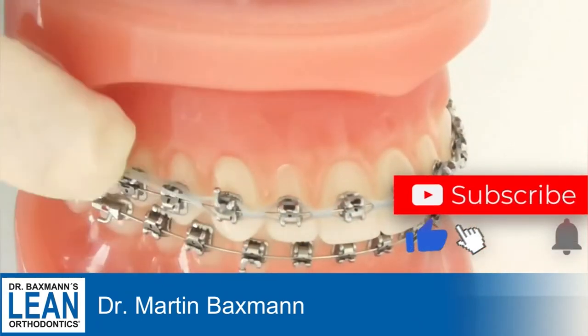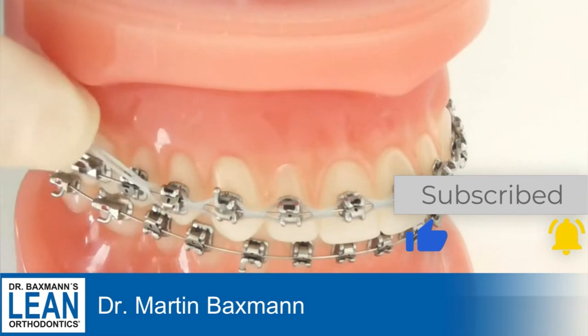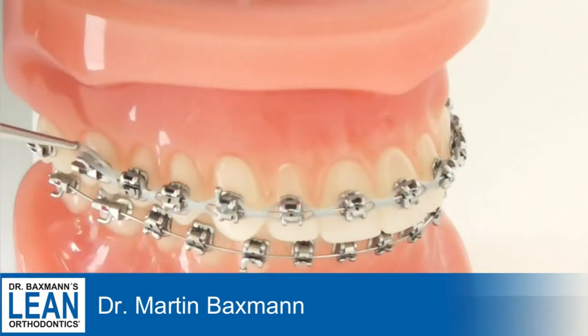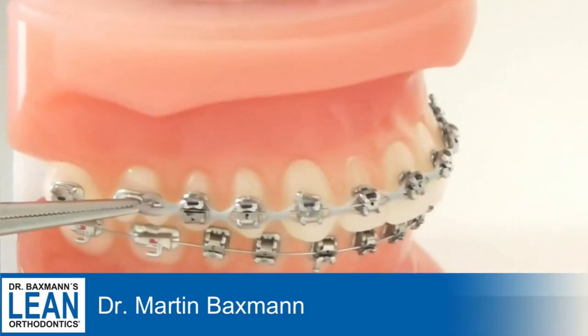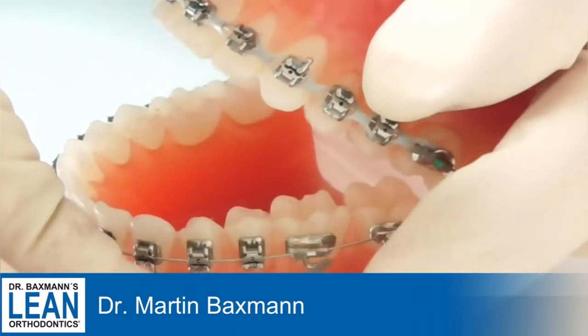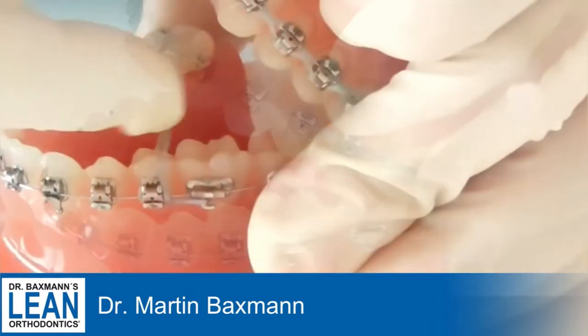We use a mosquito plier or needle holder, but I prefer the mosquito. You put it on the hook on the molar, start at the back and go around, push it with a fingernail on the bracket, pull it over the bracket, and then go to the next. That's really extremely fast.